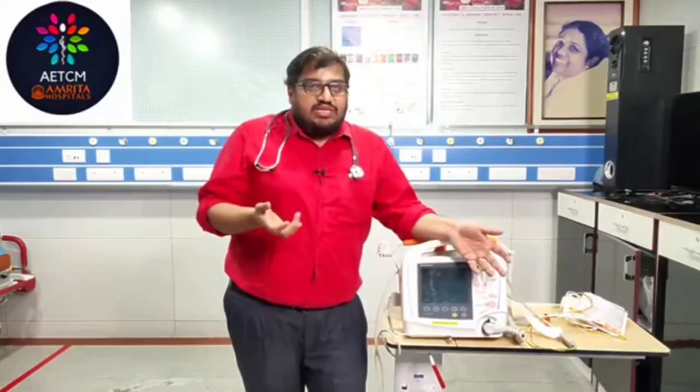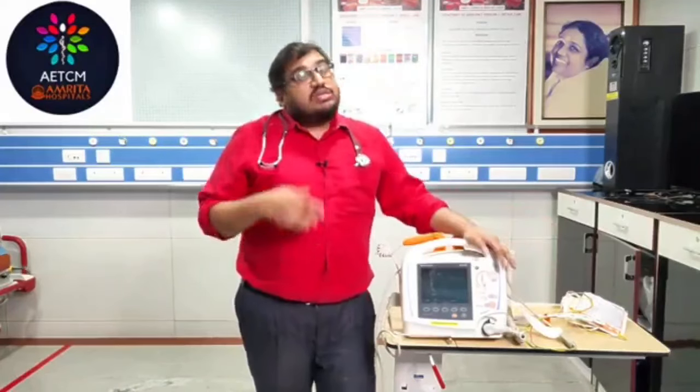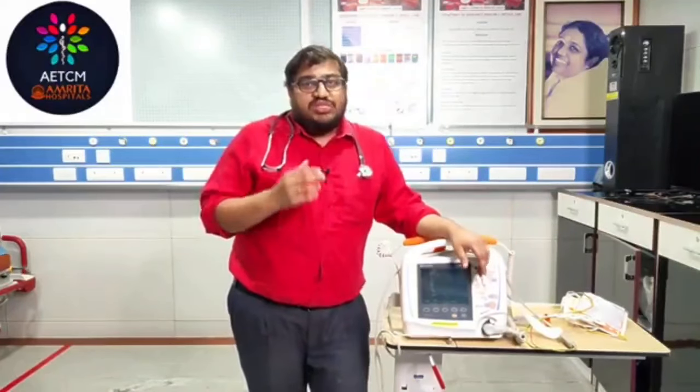Suppose this patient is on prone ventilation. In a COVID scenario, sometimes the patient might be on prone ventilation. At that time, what do you need to do? You can keep the paddles on both sides of the axilla. So you can use these adhesive paddles. That is better in case of prone ventilation. So these are the positions where to keep your paddles.